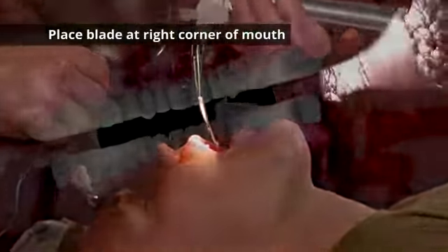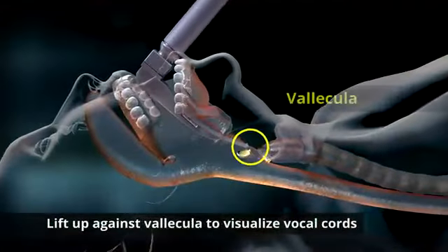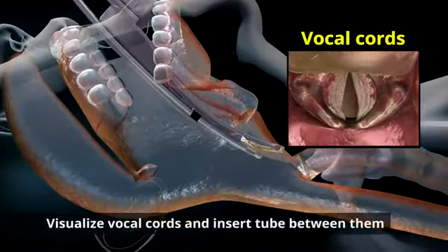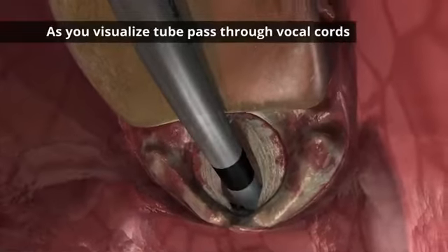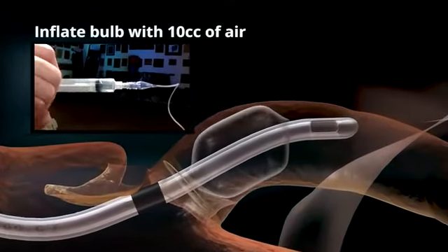Place the blade at the corner of the mouth in a sweeping motion, insert and sweep the tongue and elevate. Lift up against the mandible and visualize the vocal cords. Once you visualize the cords, insert the tube between the vocal cords. As you visualize the tube past the vocal cords, simultaneously remove your laryngoscope and inflate the cuff with 10 cc's of air.